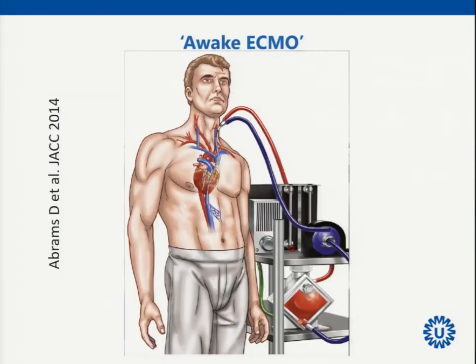And you might choose this cannula if you go for awake ECMO. But of course, if you have very, very severe ARDS, you will not be able to wake up the patient and walk around with the patient, since this is not generally powerful enough to really support your patient in a sufficient way.